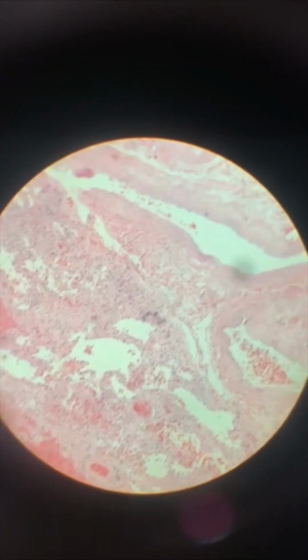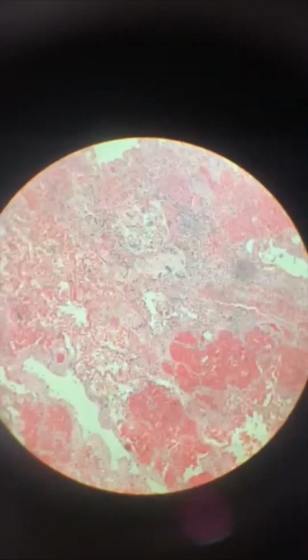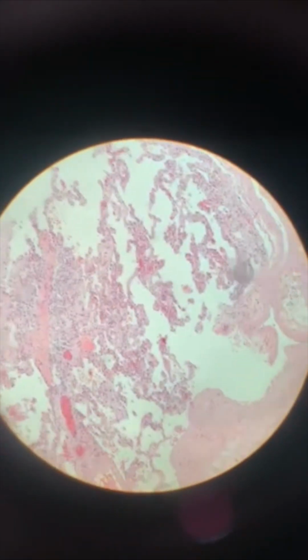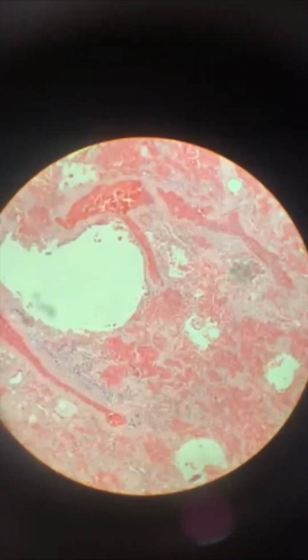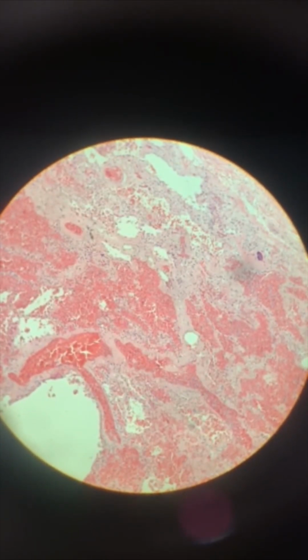Seen with one's own eyes gives credence to exactly what happened. As I peruse around in this first video of a lung section, you can see that there is extensive hemorrhage. And we're going to go down to show you, look how very normal the lung is otherwise. Nice aeration, nice dilatation of the alveolar spaces. And I'm just going to keep on perusing around, but let me show you that this is evidence. This is factual. This is not someone's opinion.